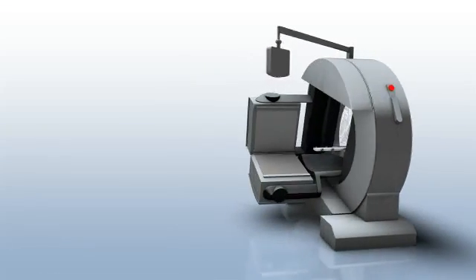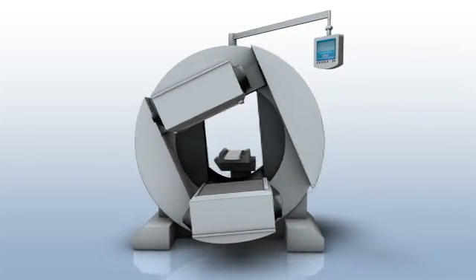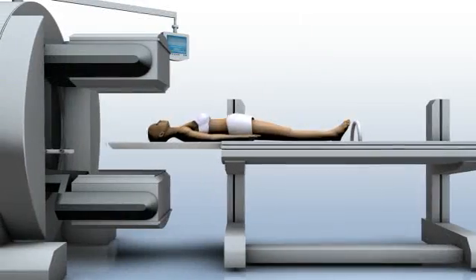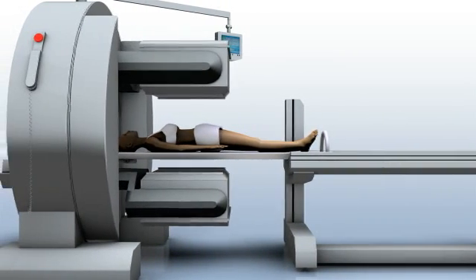Once fully assembled, the variably angled detectors allow different configurations. The thin patient support pallet and the body contouring provide improved image resolution.